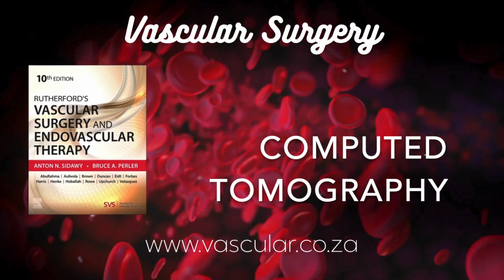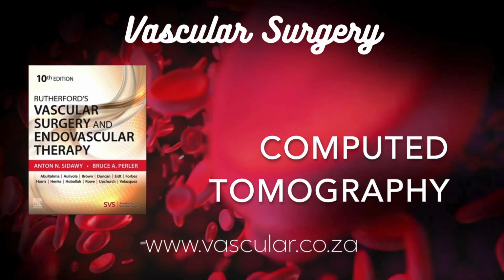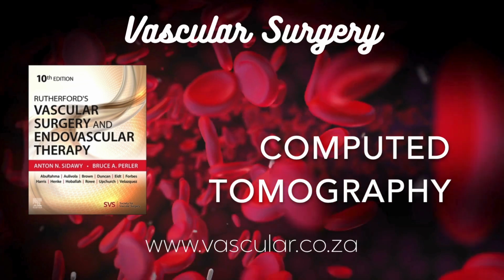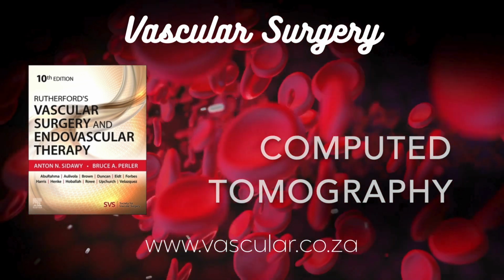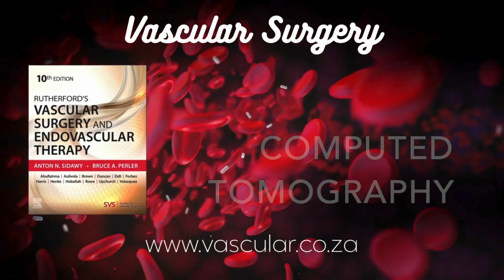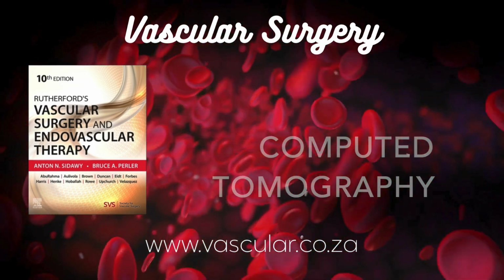Exactly. So while the risk from any one scan is low, the population burden is something we have to be mindful of. Some estimates suggest a small percentage of future cancers might be attributable to medical radiation, mostly CT. It really emphasizes the need for justification, only scan when necessary, and optimization, use the lowest dose possible, ALARA, especially in children. Right, kids are more sensitive.